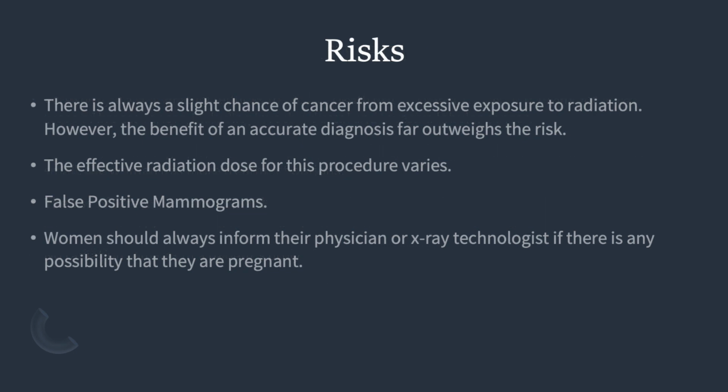Risks include that there is always a slight chance of cancer from excessive exposure to radiation. However, the benefit of an accurate diagnosis far outweighs the risk. The effective radiation dose for these procedures varies.